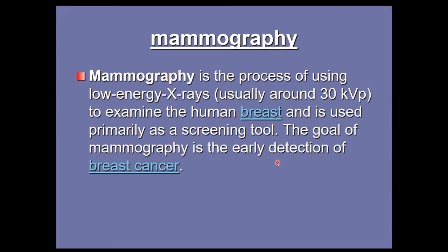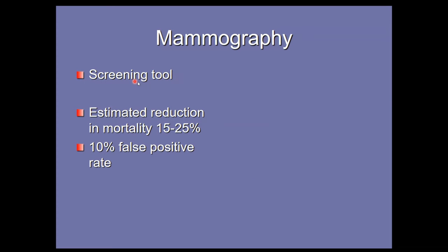The goal of mammography is early detection of breast cancer. Basically, the main purpose of mammography is screening. It is used as a screen for early detection of breast cancer. Before it is more pronounced clinically, we can detect it on mammogram, because when it is evident clinically, then most of the time it is very late. So if we are performing mammography, we can detect early stage breast cancer.